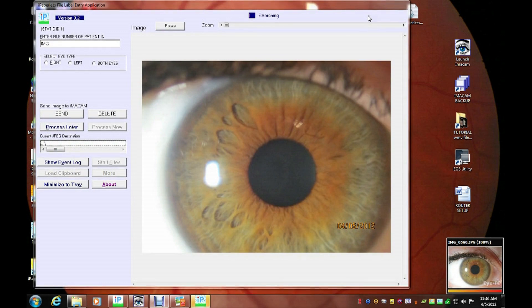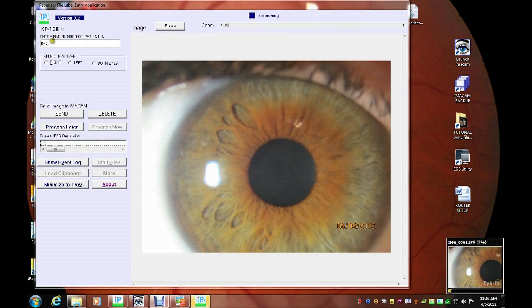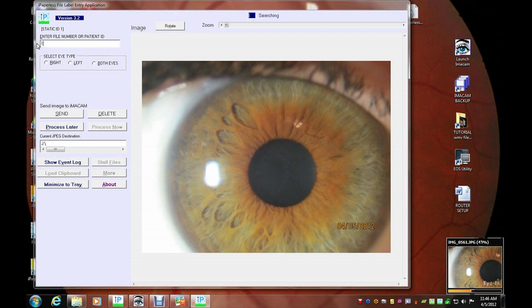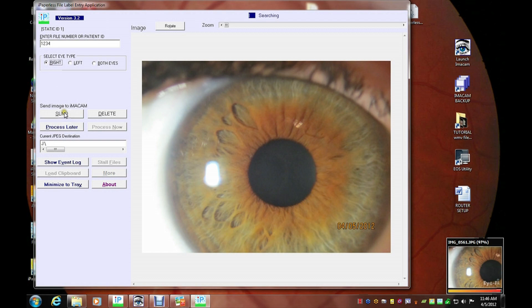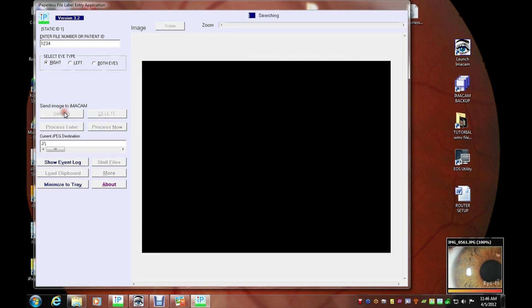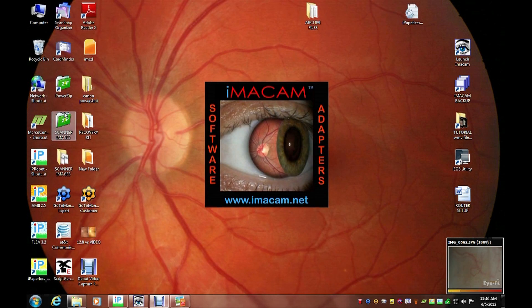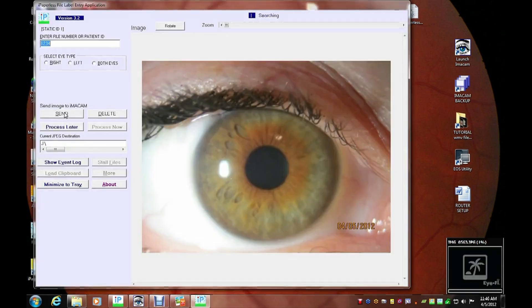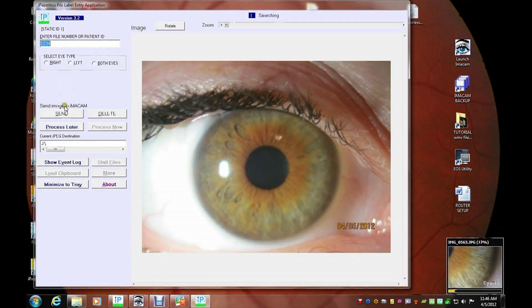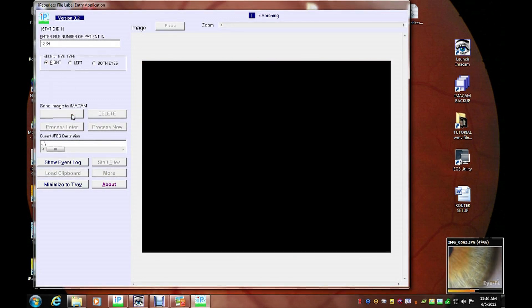The iPaperless FLEA software will then preview them full size. You simply add the patient ID and eye type and click send. The patient ID will then remain static until the next patient.